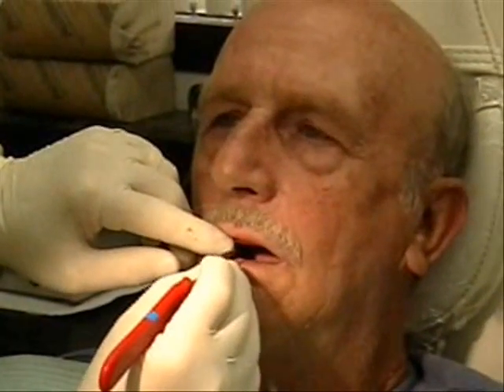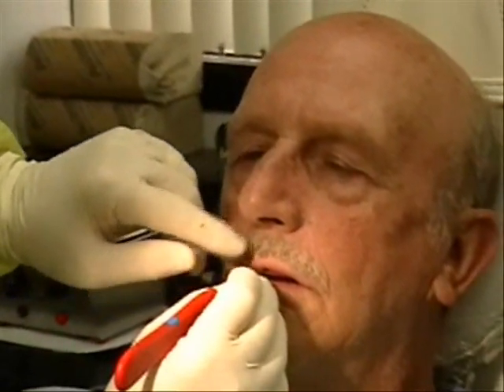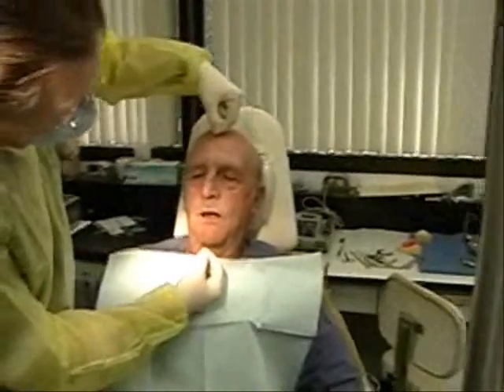Take your midline, and I want you just to relax while you open just a tiny bit. Right down the front of there, then drop straight. Smile for me. Come right down here and go straight down here. Smile for me. Looks pretty good. What do you think, Joe? His nose is off — right down the center of his forehead and down the center of his chin. The philtrum looks okay — just about right. Yeah, actually I think it looks pretty good.